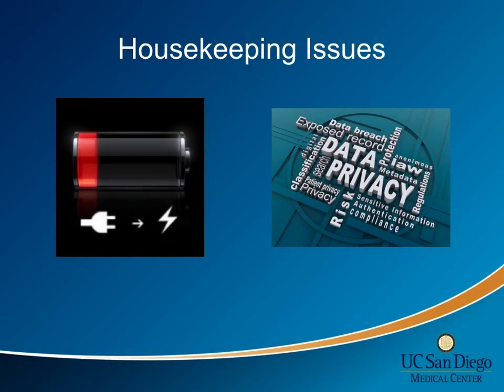With that, one last word on housekeeping issues. Please remember to fully close out each study once you have finished so that patient information isn't left up on the screen. When not in use, please remember to plug in the machines. It's always handy to have a fully charged battery when you are grabbing the machine for a critical patient and not having to worry about plugging it in because of a dead battery.